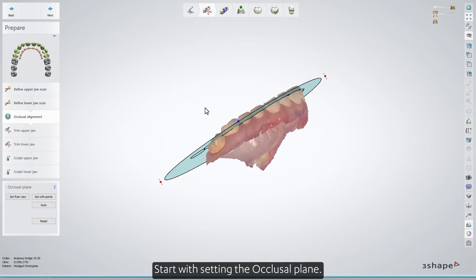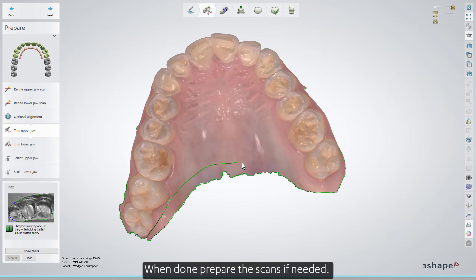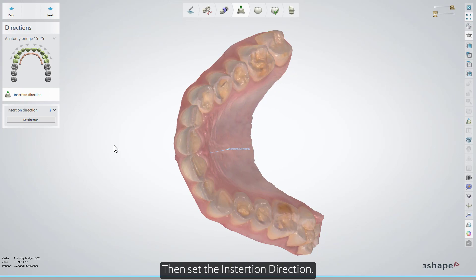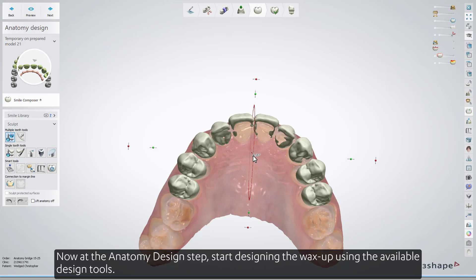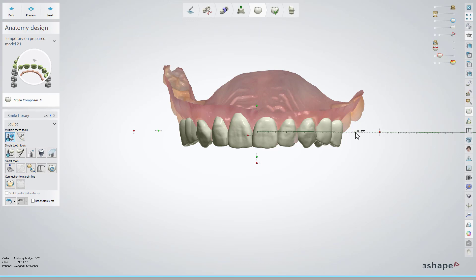Start with setting the occlusal plane. When done, prepare the scans if needed. Then set the insertion direction. Now, at the anatomy design step, start designing the wax up using the available design tools.